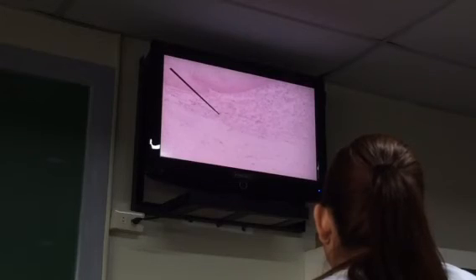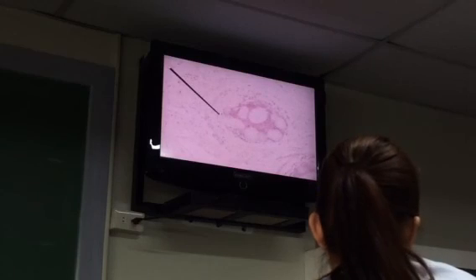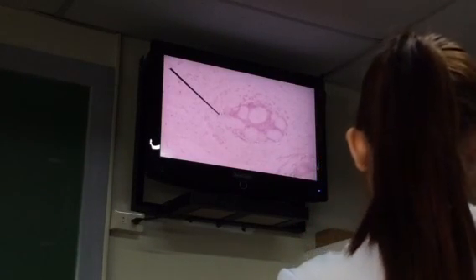Another thing we'd like to look for here are these glands. The glands look nicer here. These are your urethral glands, otherwise known as Littre's glands. Littre's glands or your urethral glands. There you go. Okay. So those are the things we'd like you to study for today.